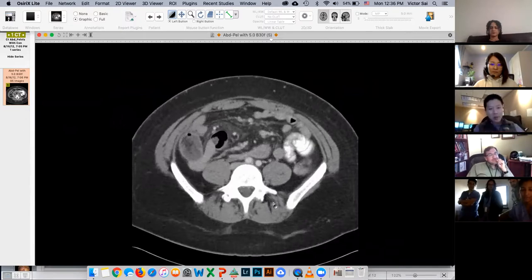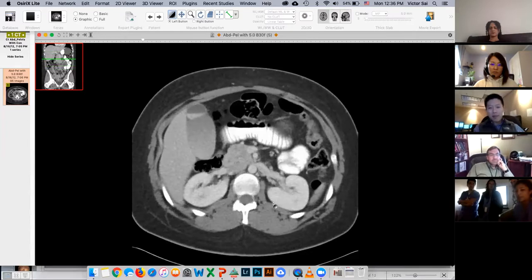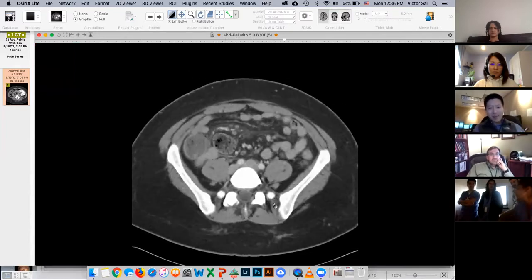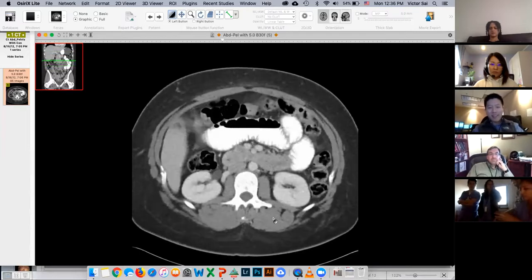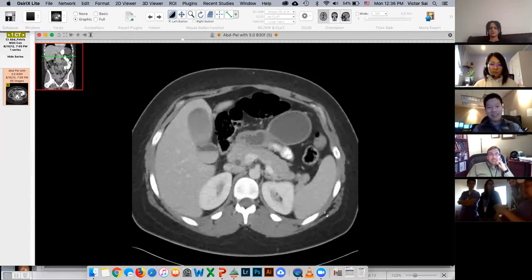Many of the people who read our ER cases are not abdominal trained, but they are trained to tell that something is abnormal, and there's actually a very low threshold for the ER doctors and the surgeons to take these patients, especially those who have had Roux-en-Y gastric bypass, to a laparoscopy. And we are also kind of trained to have a low threshold for suggesting that something may be abnormal. This is for the abnormal, but sometimes it's not so clear cut.